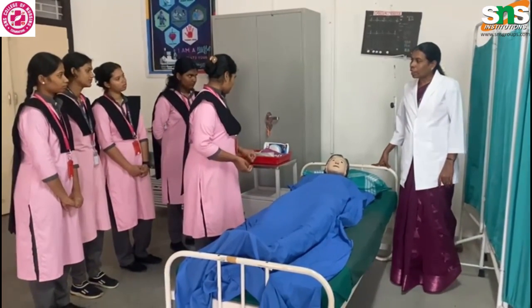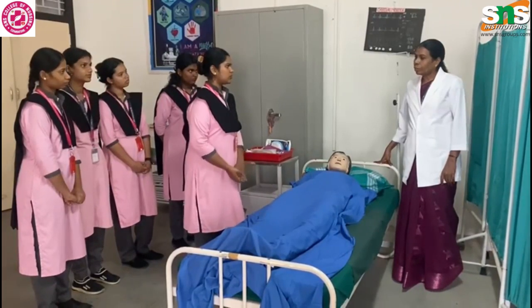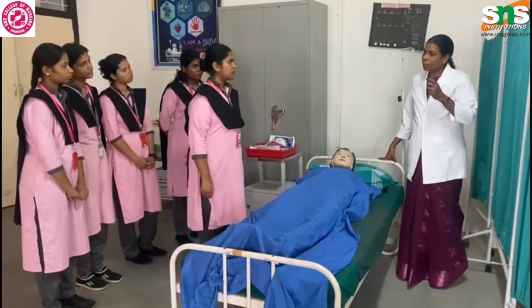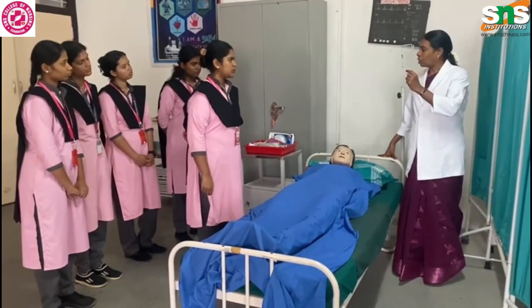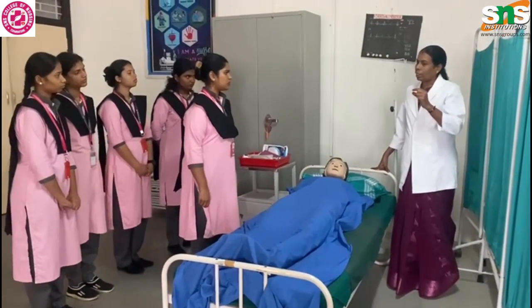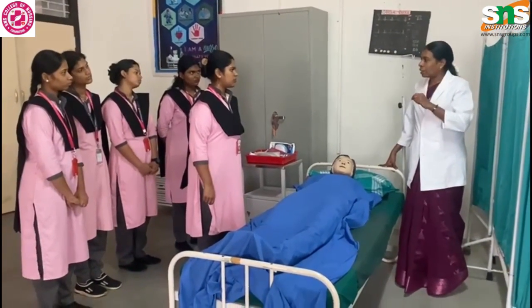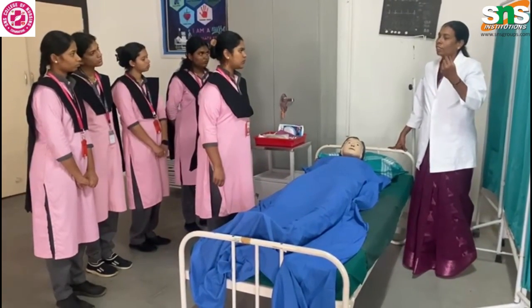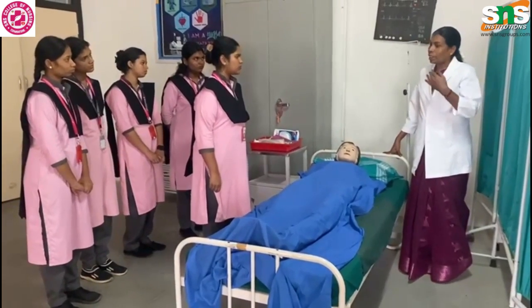Next, one more method to check the NG tube position is X-ray. By seeing the X-ray, we can see the many holes given in that NG tube. Previously, instead of holes, metal balls were present in the NG tube. By seeing that in the X-ray, we knew the tube was in position. Nowadays they are replaced. Why?